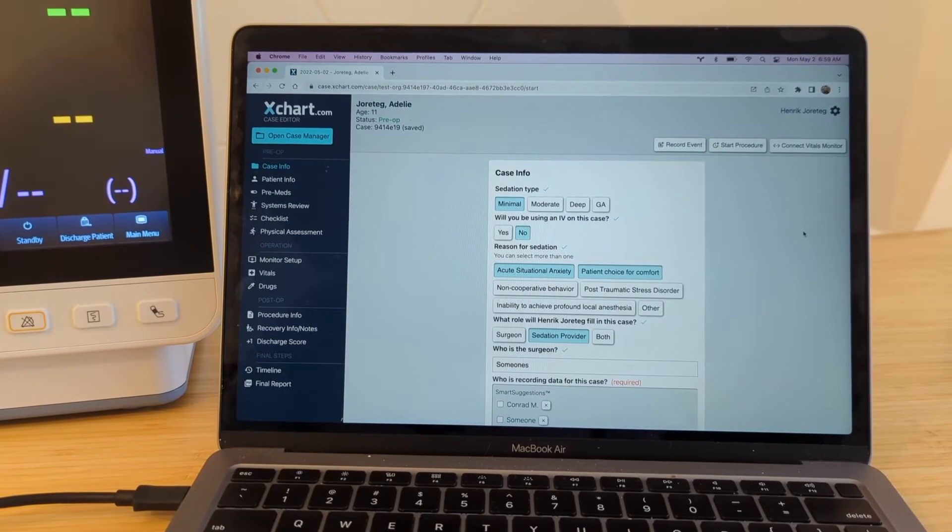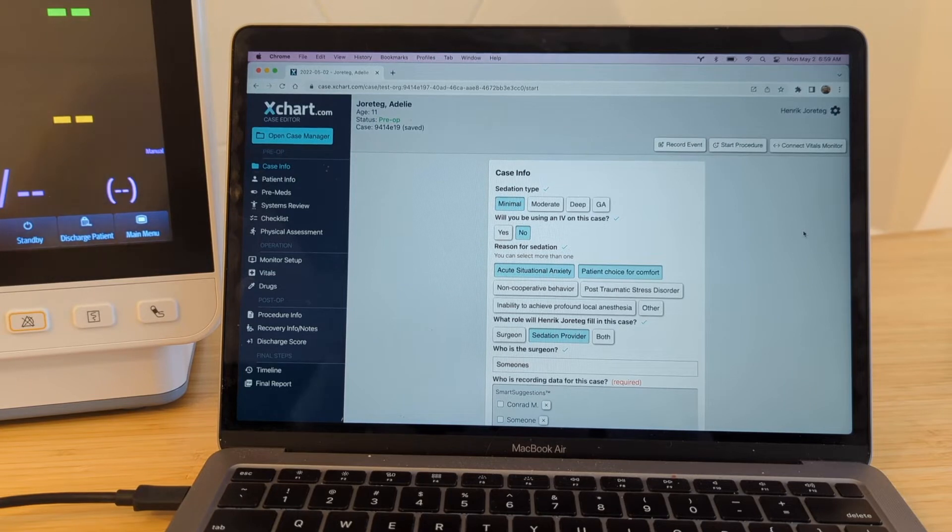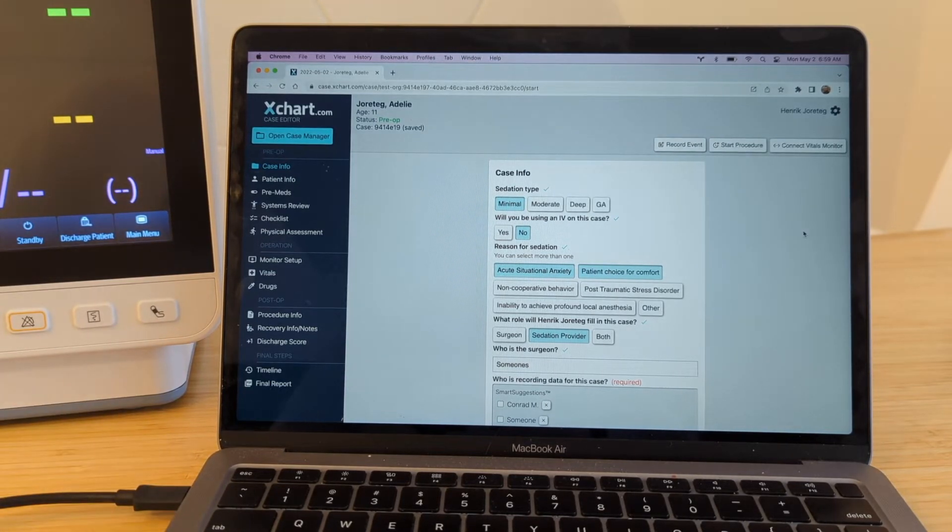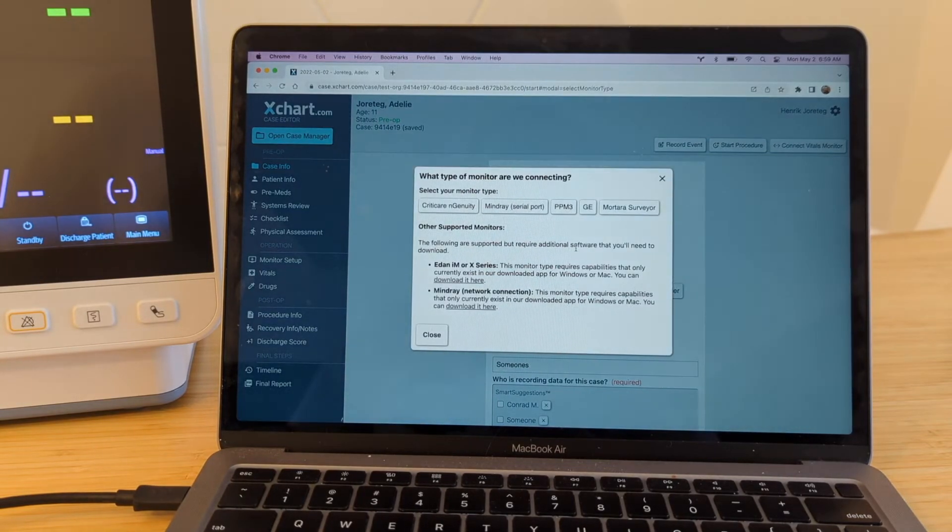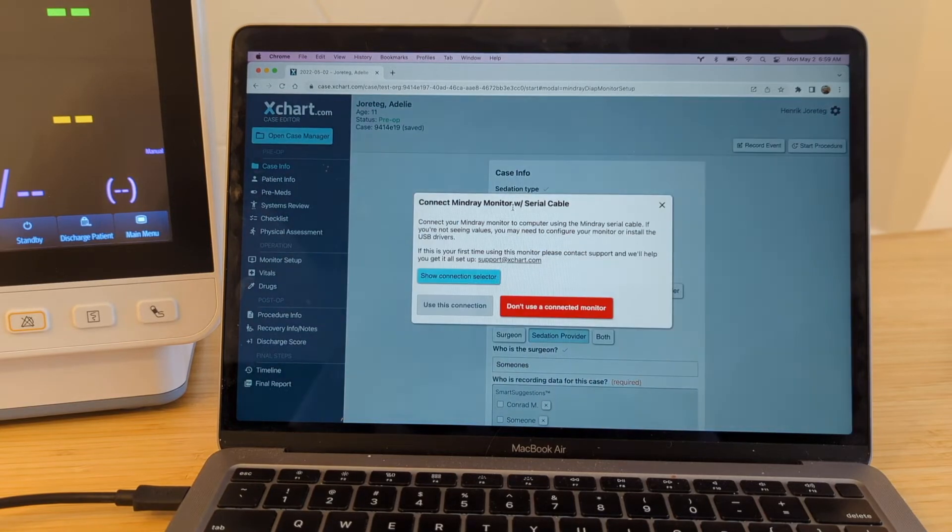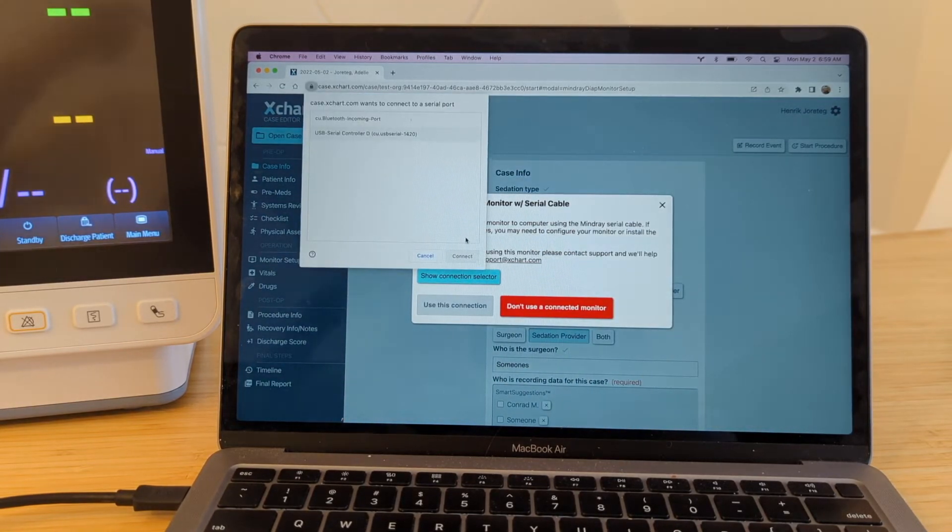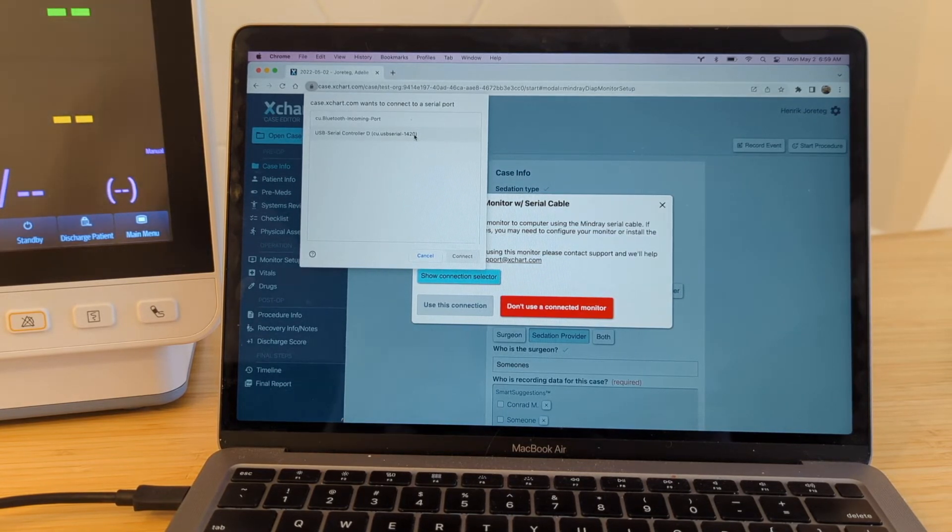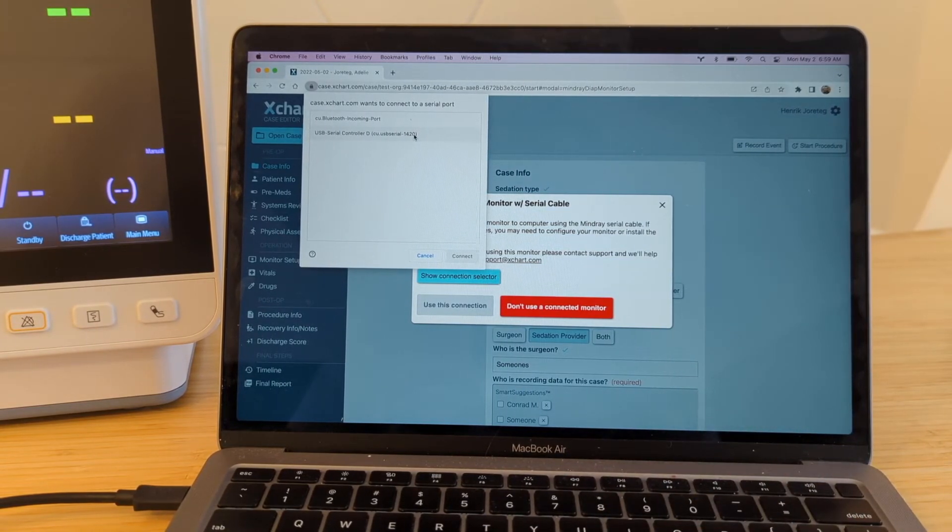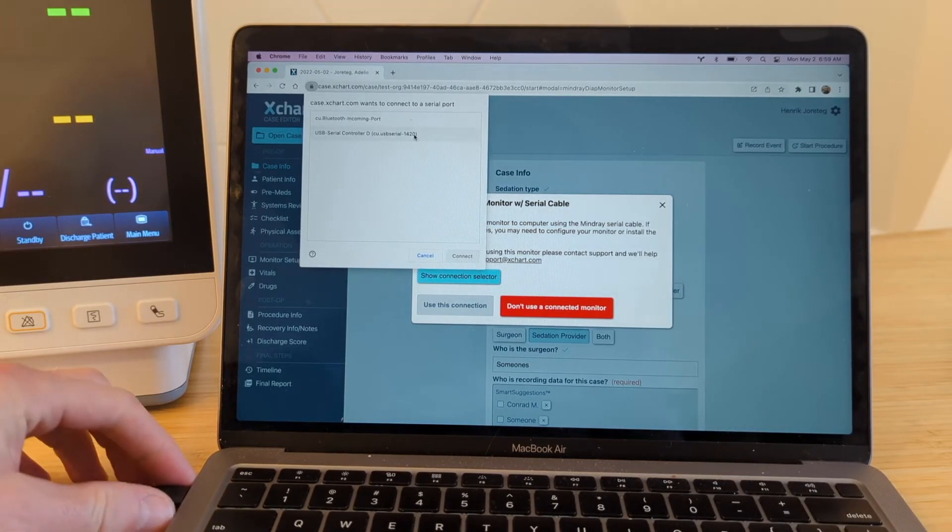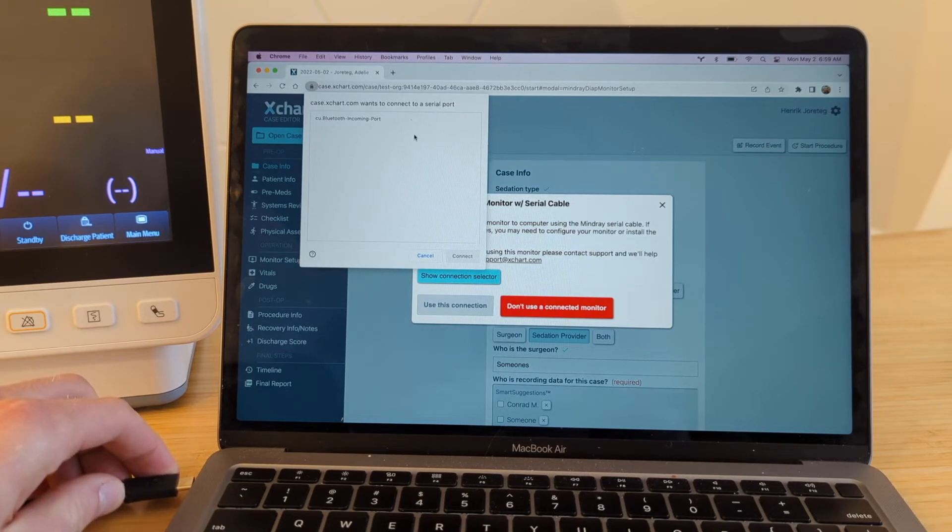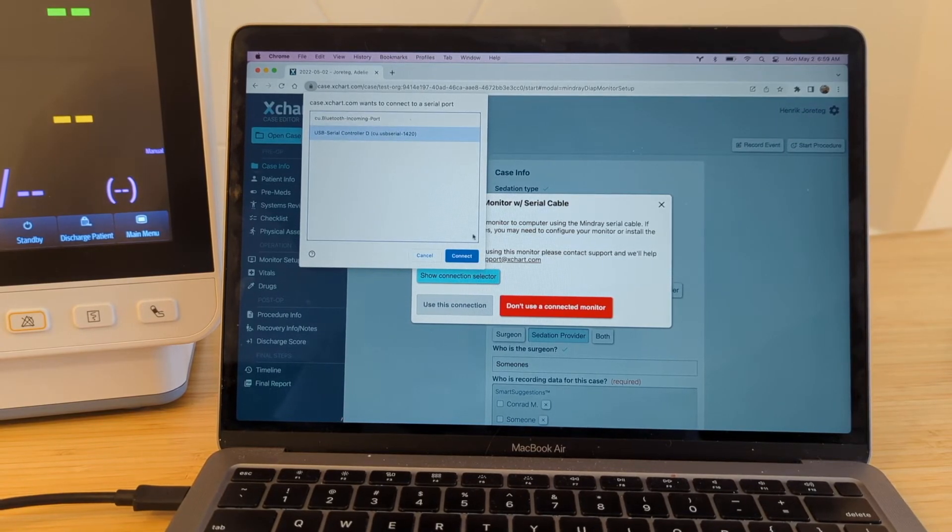Okay, so now we have xchart.com open. We've opened a particular case here that we want to use. Everything is hooked up. You can see the USB cable is plugged in here. And now what we're going to do is we're going to go up to Connect Vitals Monitor up here in the corner. And we're going to select MindRay Serial Port. And then you want to go to Show Connection Selector. And you may have multiple items here. There are sometimes like internal serial cables or serial connections or other things that you may have hooked up to your computer. The one thing that you need to make absolute sure you connect the right one is just to be able to unplug it and plug it back in. So the one that disappears and comes back is definitely the one that you want. So go ahead and do that and select the one that showed up and hit Connect.